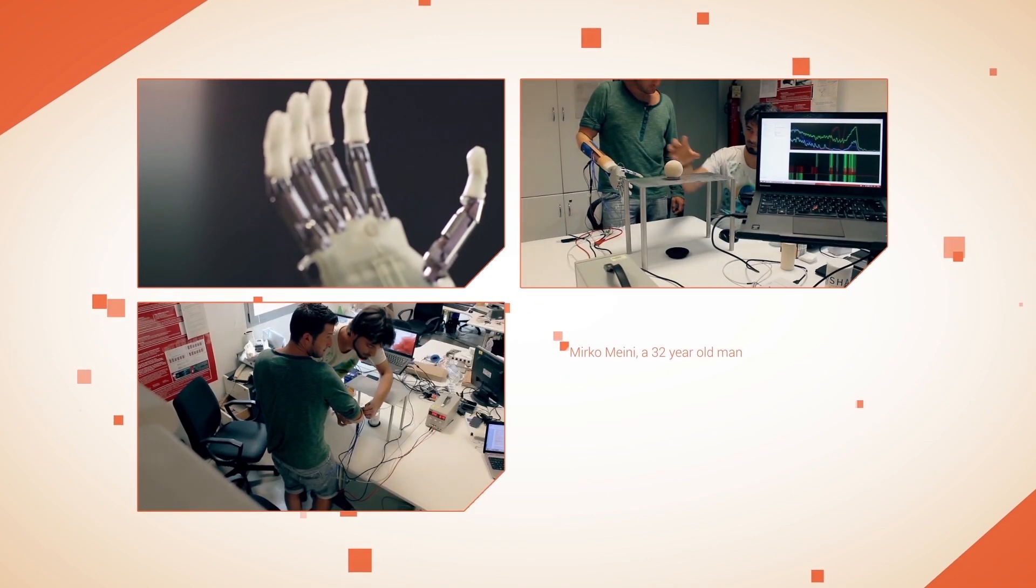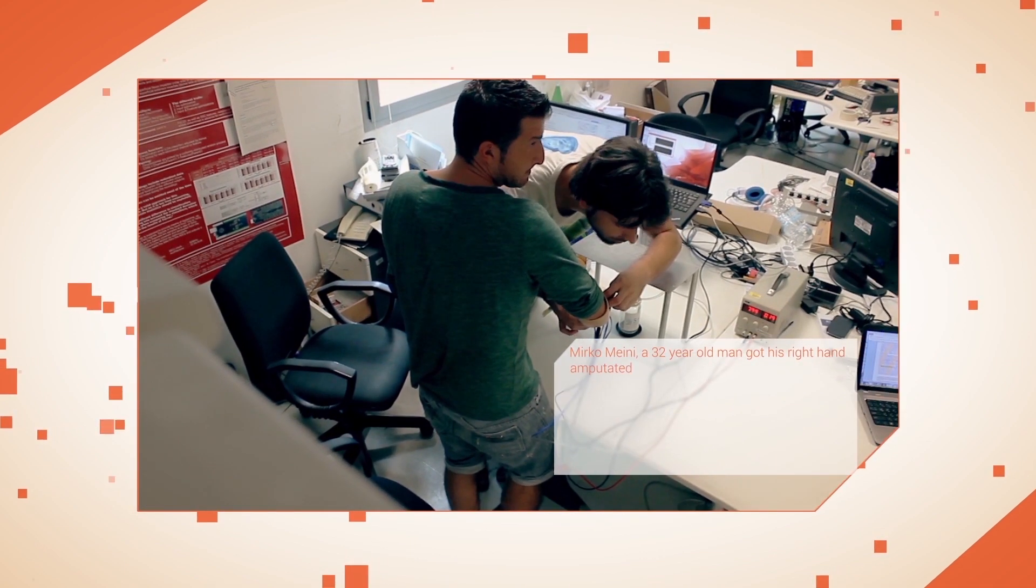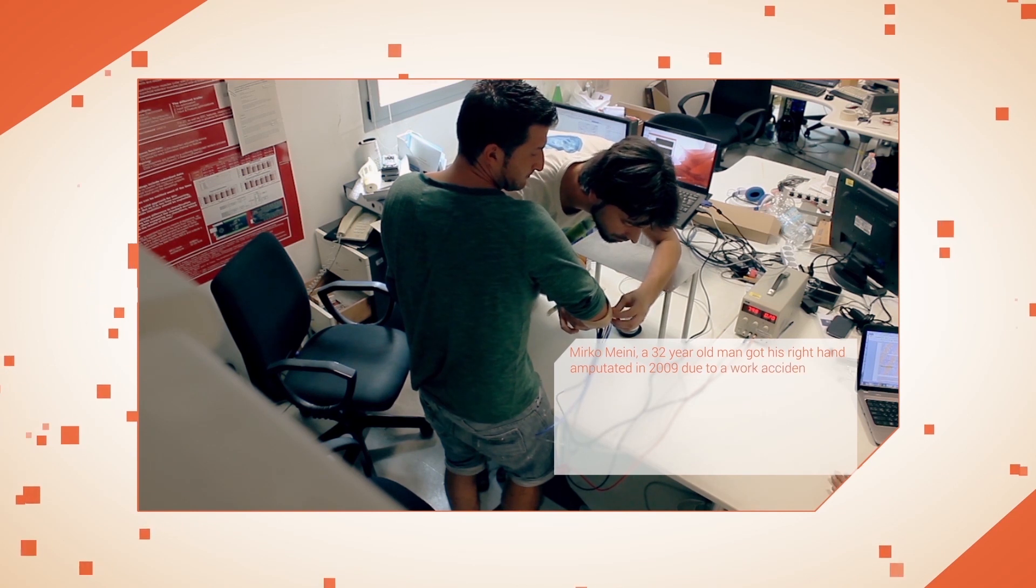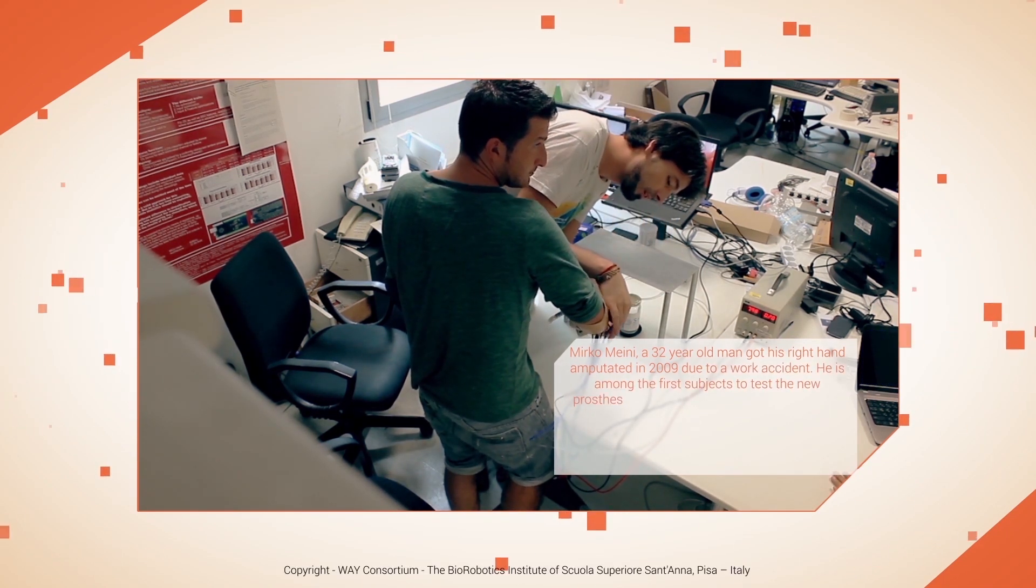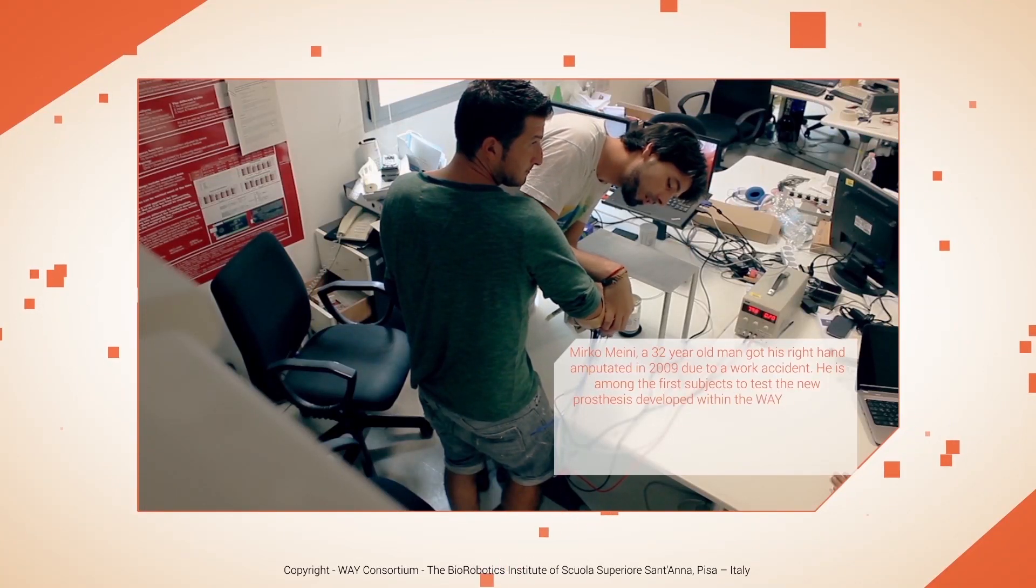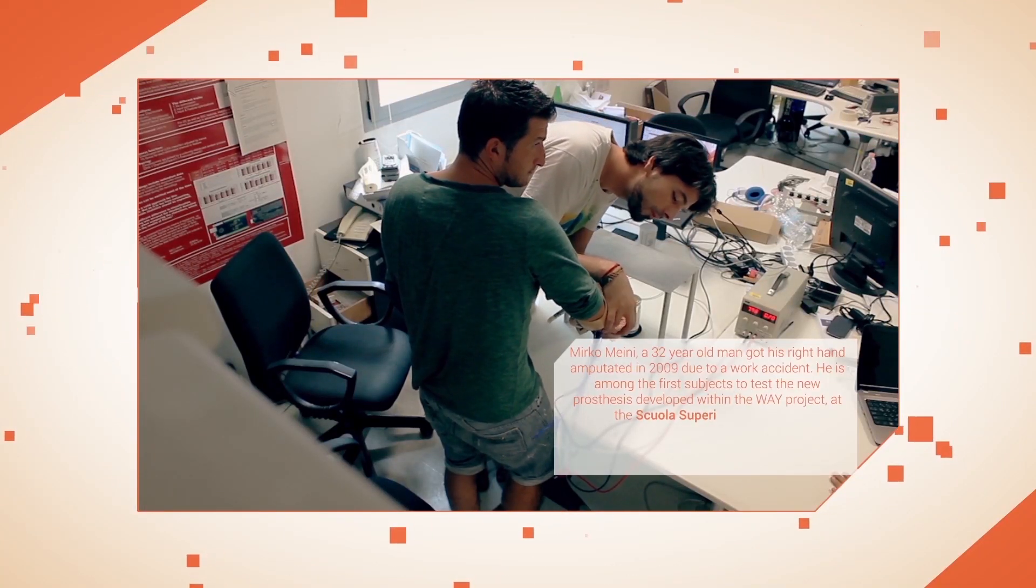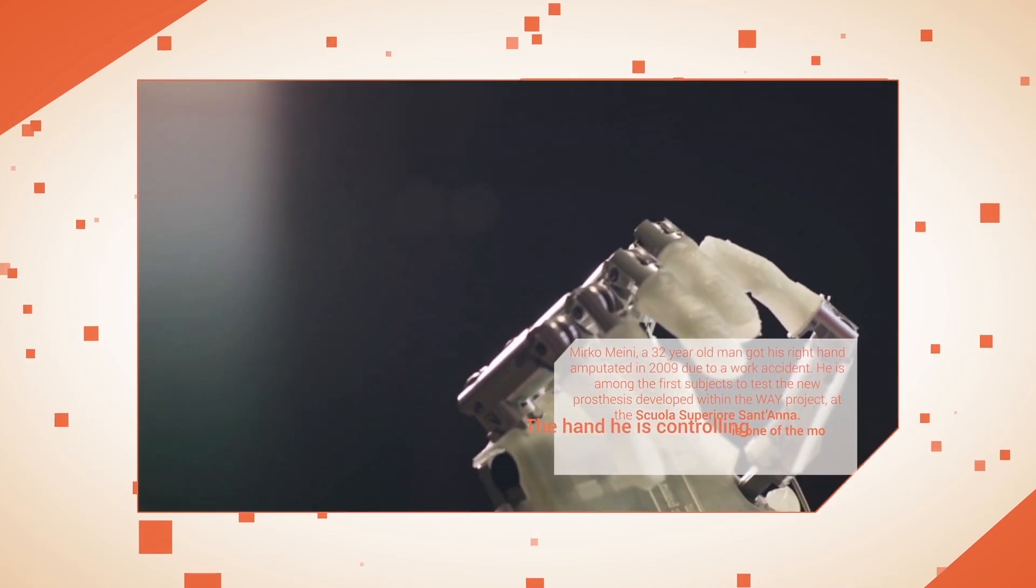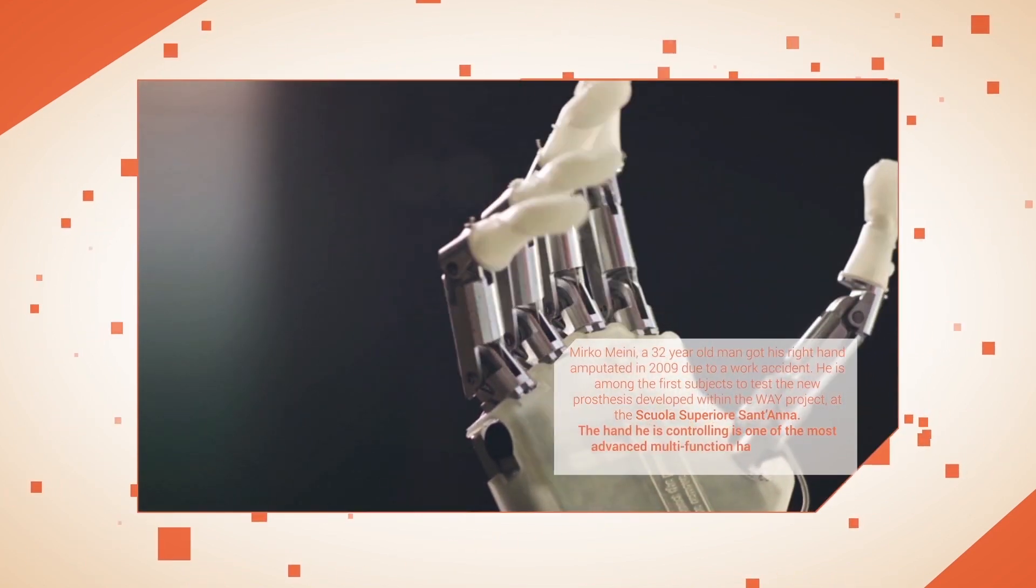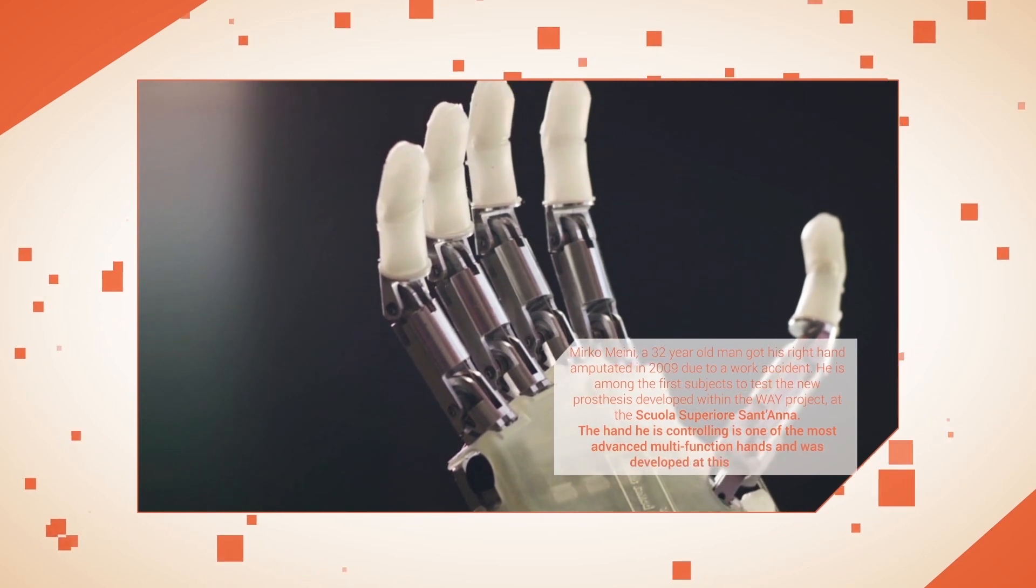Mirko Menini, a 32-year-old man, got his right hand amputated in 2009 due to a work accident. He is among the first subjects to test the new prosthesis developed within the WAY project at the Scuola Superiore Sant'Anna.